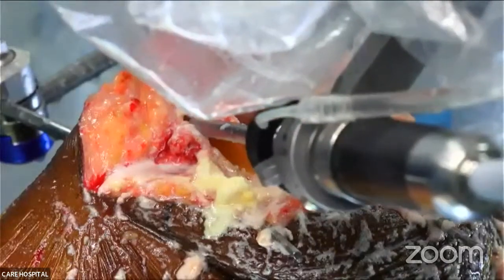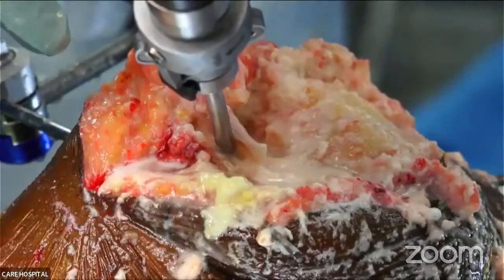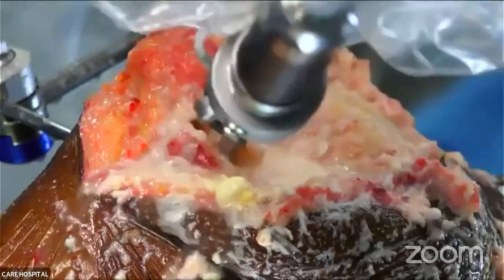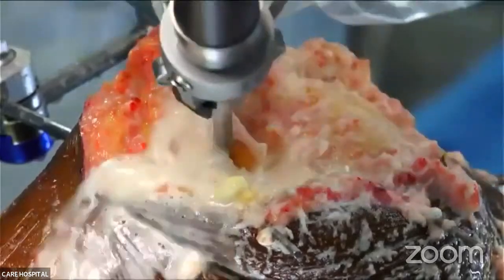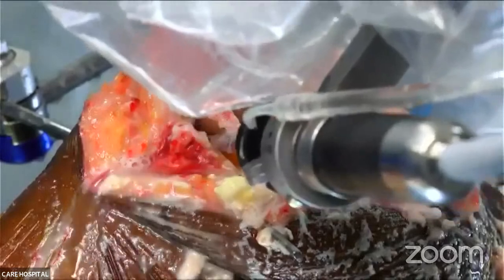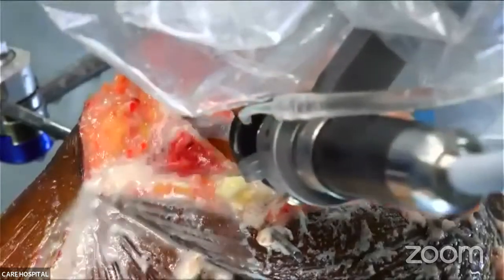So you can see that for the medial cut, it goes from front to back and then cuts medial to lateral. But for the lateral cuts, it is coming from the anteromedial aspect and coming from anterior to posterior. So you don't have to retract the patella with the help of a Homan, because it is not coming in the way of the burr.